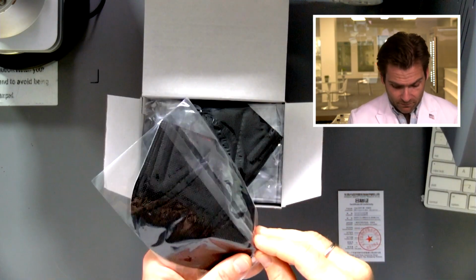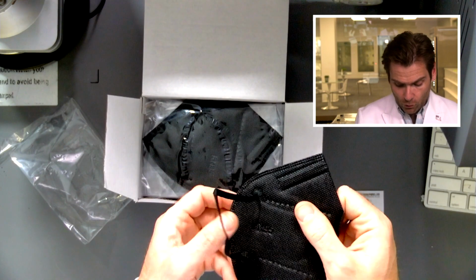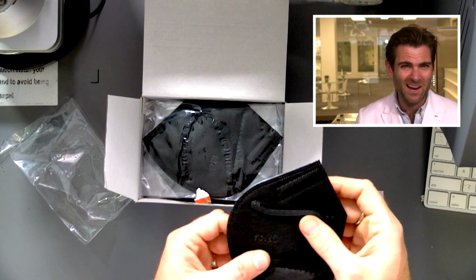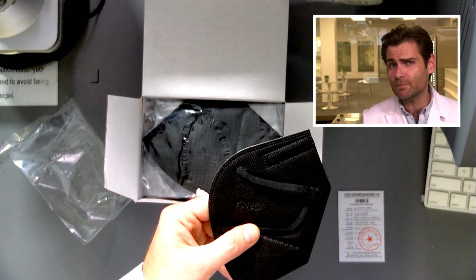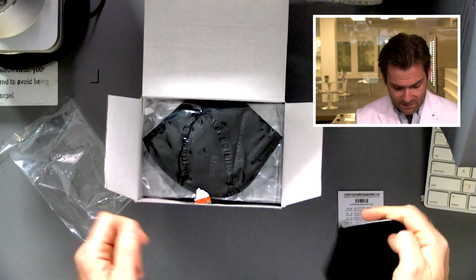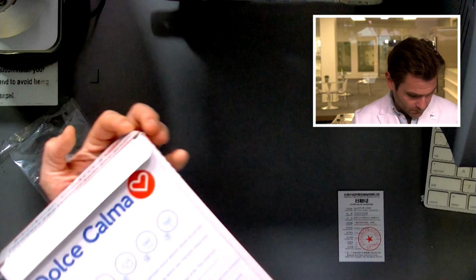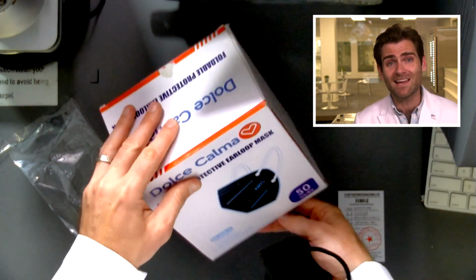I can tell that they are not a legitimate KN95. I am a broken record if you've seen more than one of these videos. But here's a quick trick. You do this at the mall or parties, call people out, you know, in the line at Starbucks, be like, excuse me, ma'am, you don't have a legitimate KN95 because it just says KN95 on it. You actually need to have the manufacturer name and the standard. And this is probably, actually, it doesn't even say that. Oh, it does. Here we go. GB 2626-2019, needs to say all of that on there.